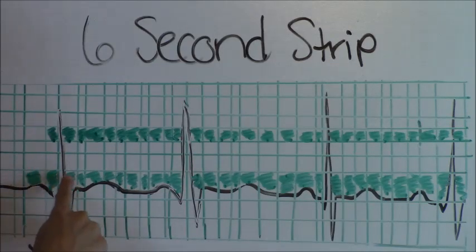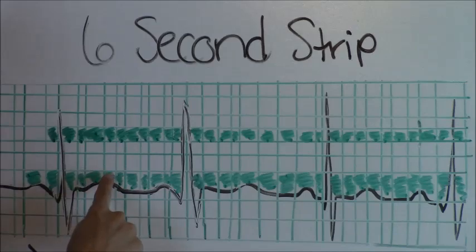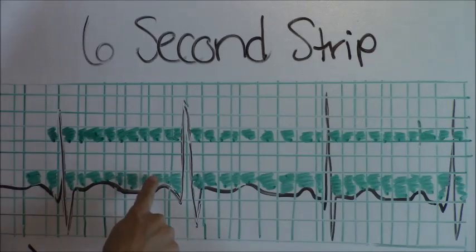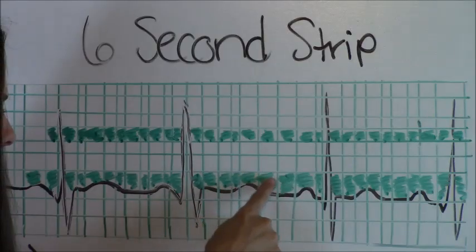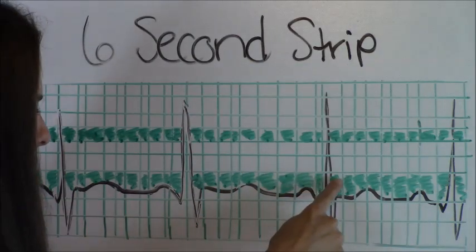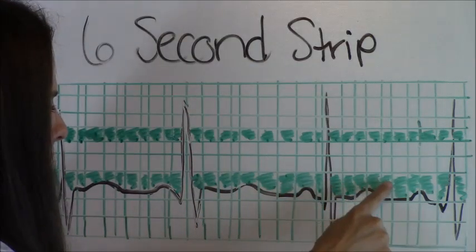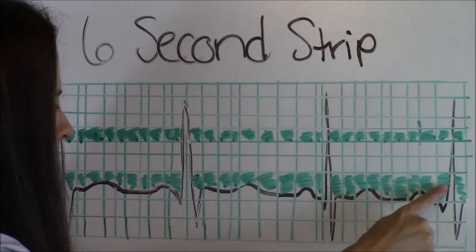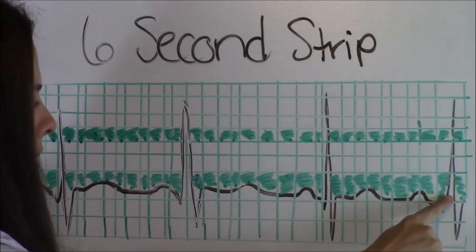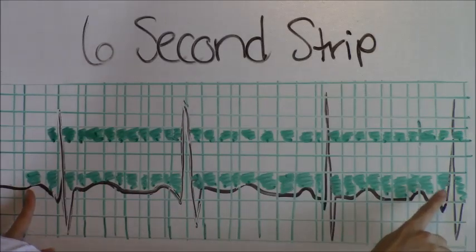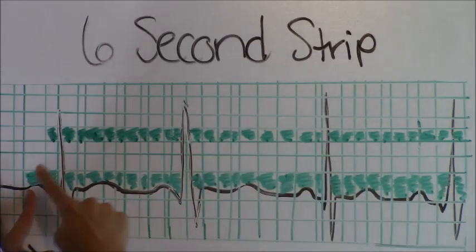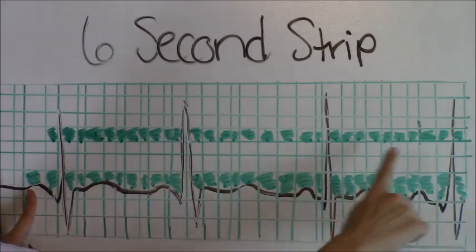We have 1, 2, 3, 4, 5, 6, 7, 8, 9, 10, 11, 12, 13, 14, 15, 16, 17, 18, 19, 20, 21, 22, 23, 24, 25, 26, 27, 28, 29, 30. So right here is where we'll stop. So we're going to measure from here to here. And how many P waves do we have in between that? We have one, two, three, four.